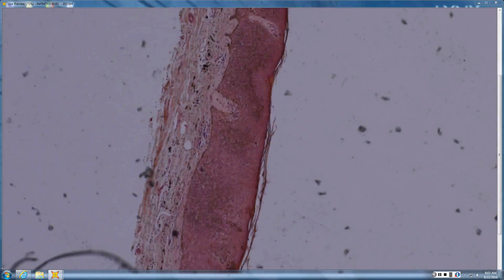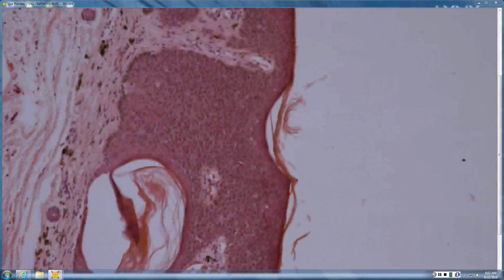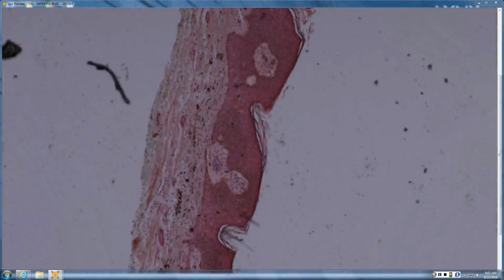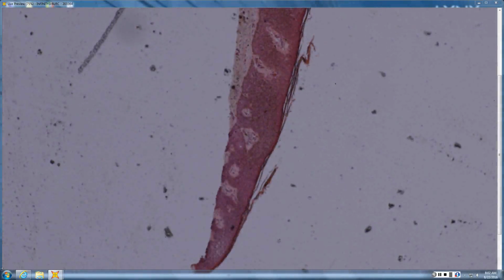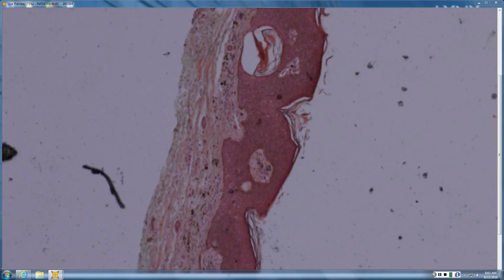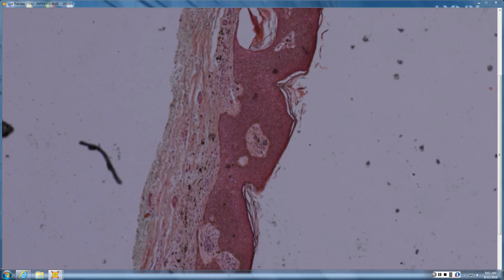This is a very superficial shave with pigment in the dermis. Okay, and so there's cells that are smaller than the surrounding cells, and they're forming pigmented little clones. So very much the size of cells in hidroacanthoma simplex, and those are the same size as what other tumor? Given that we have horn cysts here. Like a clonal seb, yeah, like a clonal seborrheic keratosis, which is in the differential for hidroacanthoma simplex.